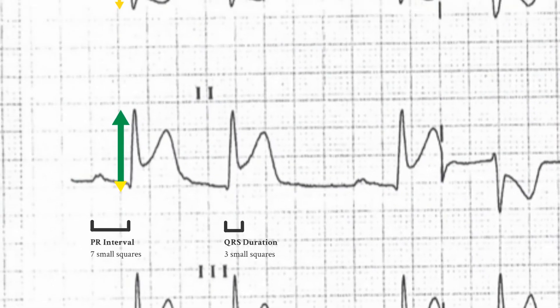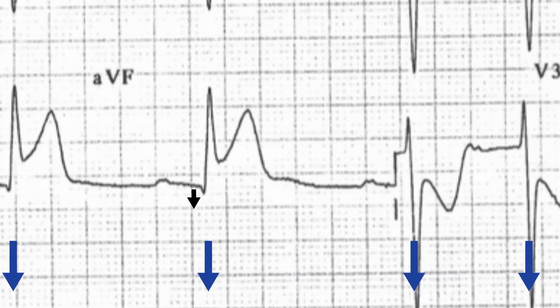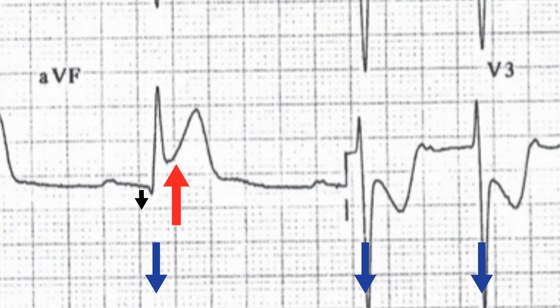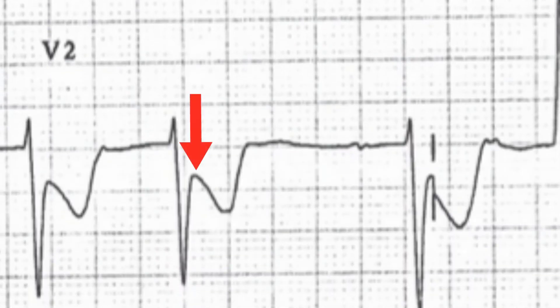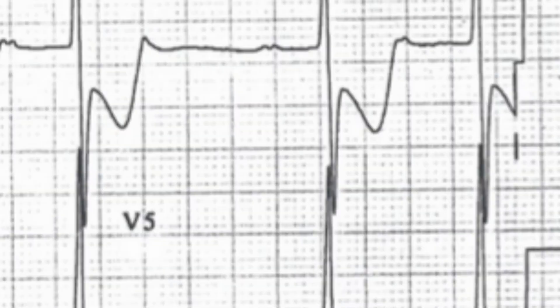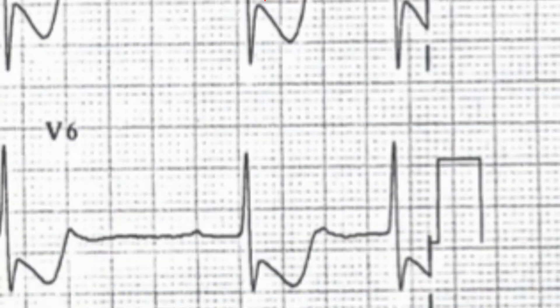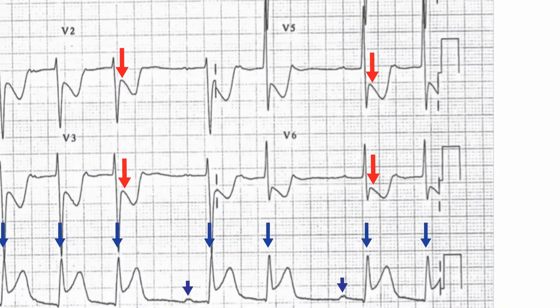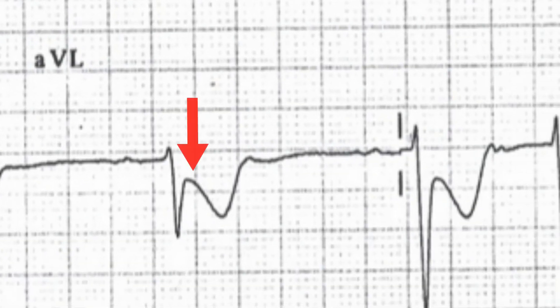There is ST-segment elevation present in leads 2, 3 and AVF. There's ST-segment depression in leads V1, V2, V3, V4, V5, V6, lead 1 and lead AVL.